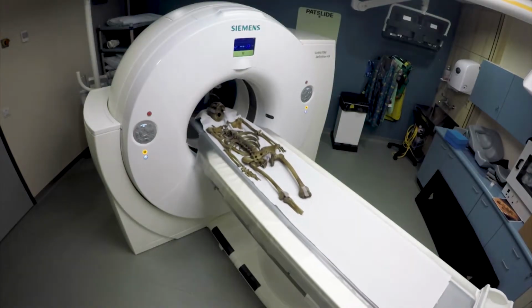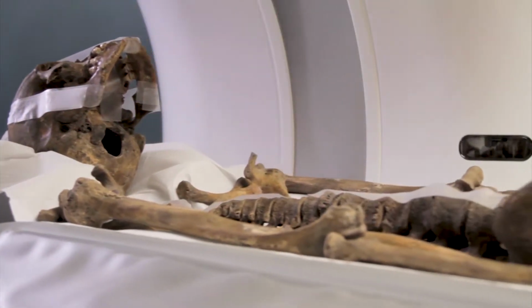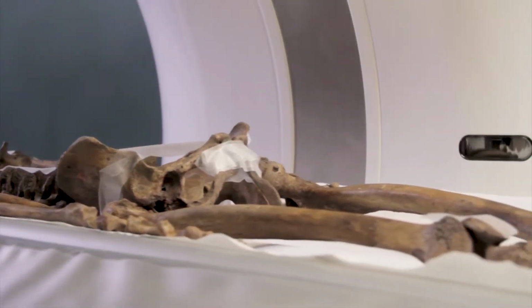And the more dense tissues, like the bones, come out as whiter on the picture, and the less dense things like hair are blacker. So there's a grey picture formed. A CT scanner also uses X-rays to create the picture, but this time the detector, instead of just being fired once from the front, rotates in a circle around the area being scanned, and also the area being scanned will move through the scanner at the same time. So what you end up with is a whole volume of information about the densities of the tissues.